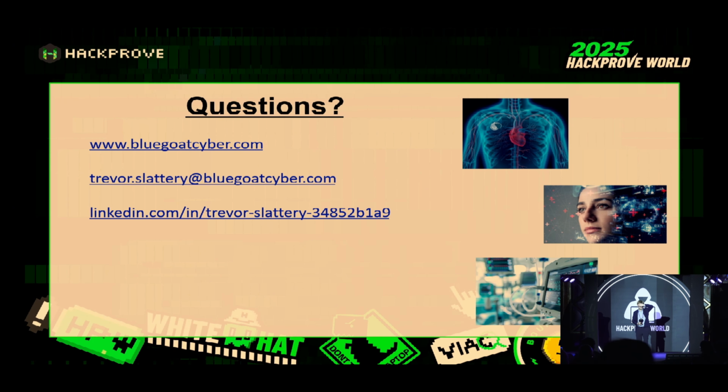When using threat frameworks for threat analysis, how can threats be identified as comprehensively as possible? It's a great question. So it gets into that review cycle a little bit. If you go through a penetration test, you dig up something that was not identified in threat modeling, then that means that you messed something up. Now, part of the tricky area is figuring out if you messed up before that. So that's why blending different threat modeling frameworks can be a good approach.